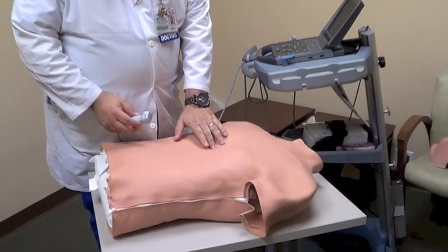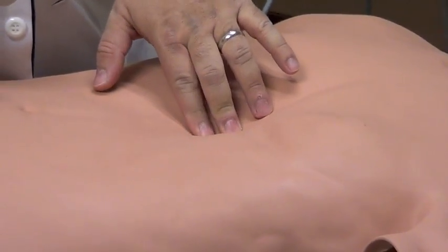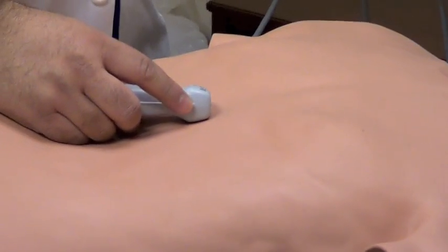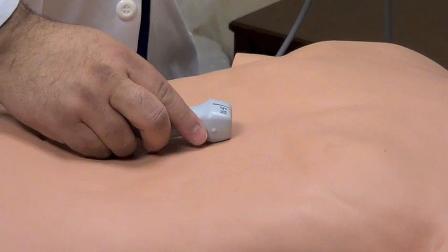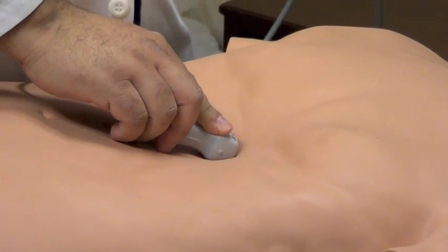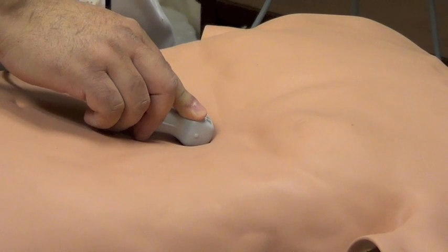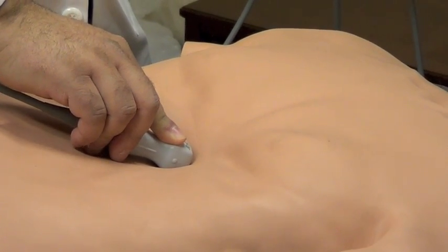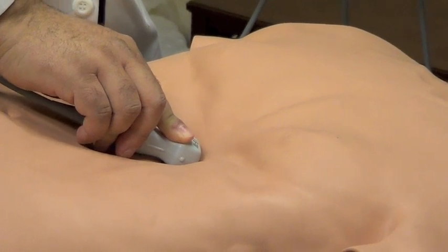You should be at the level of the subxiphoid, about one to two centimeters down. In this case, we're going to be pointing our indicator towards the patient's left side, and you want to go as parallel to the skin as you can. You're going to tell your patient that they're going to feel a little bit of pressure as you go down and point towards the heart.